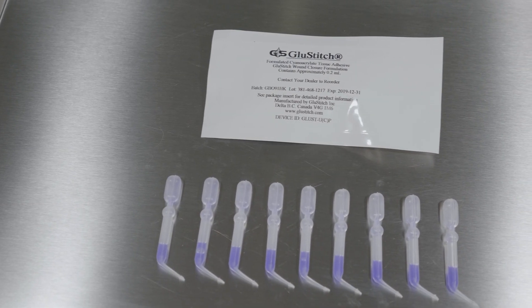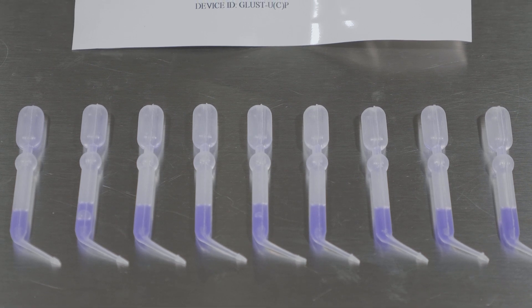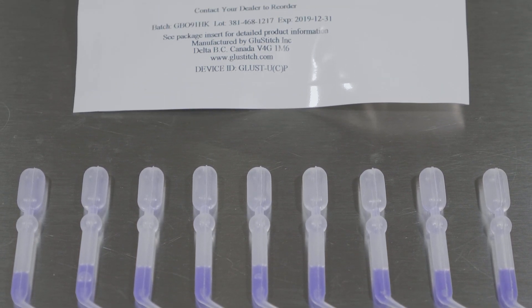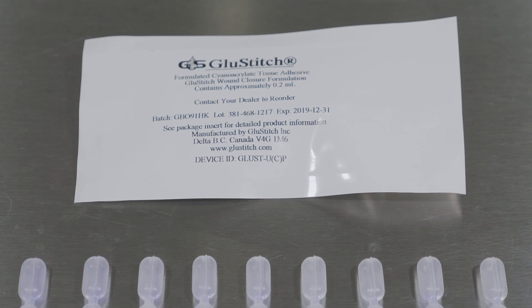Glue Stitch is a cyanoacrylate tissue adhesive used to close lacerations or surgical incisions. Glue Stitch comes in a box of 12, 0.2 milliliter pre-filled sterile pipettes.